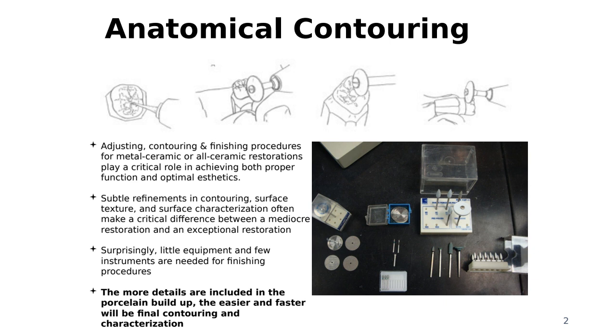So if I'm doing Emax, I will have a set of burrs and stones just for Emax. If I do zirconia, I'll have a set of stones for zirconia. I'll never mix them, even though they're all ceramics, because their composition is different. One is lithium disilicate, the other is zirconia and yttrium. Two different materials. So if I use one set of burrs for both of them, they can cross-contaminate.